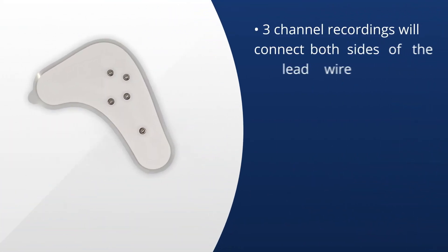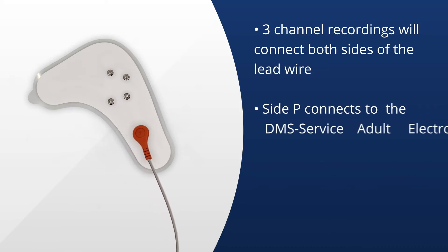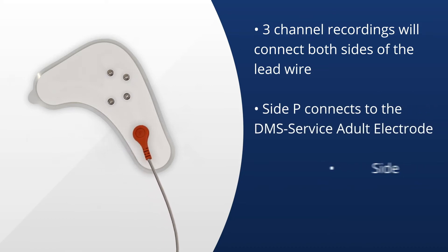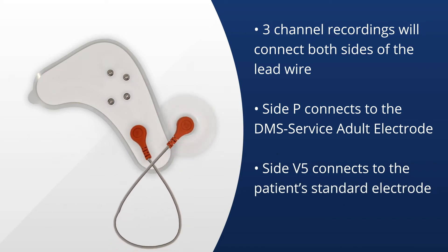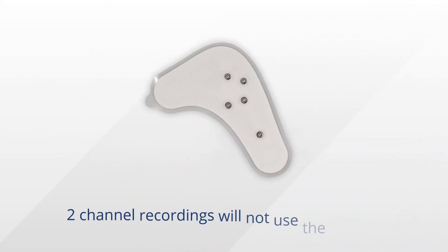For three-channel recordings, snap the end of the lead wire labeled P onto the open snap on the bottom of the electrode. The other end of the lead wire labeled V5 will connect to a standard electrode, which will connect to the standard pre-cordial lead V5 placement. If you are doing a two-channel recording, there is no need to connect the lead wire.